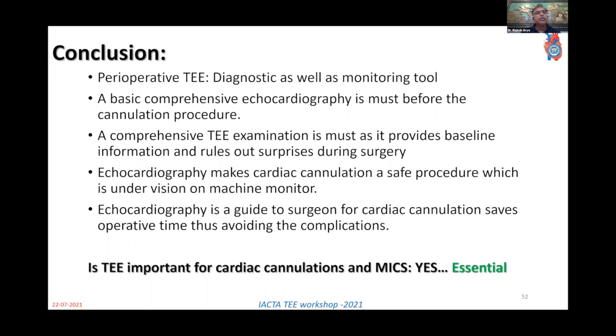So the final answer: is TEE important for cardiac cannulation and MICS, minimally invasive surgeries? The answer is yes. And I would say it is essential for all these procedures because it makes the life of the surgeon comfortable and it avoids a lot of complications.